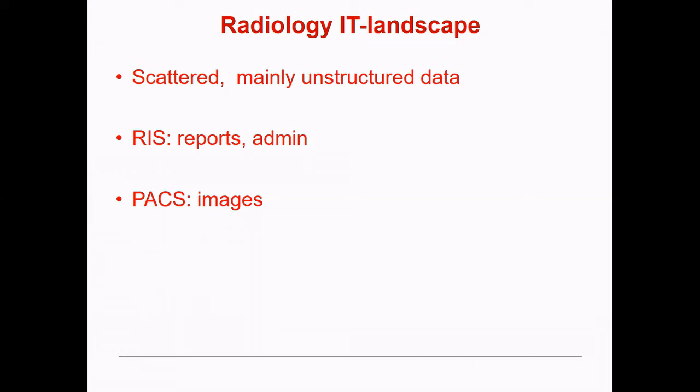First of all, even within radiology we have at least two silos. One is the RIS, or Radiological Information System. In there may reside reports, like the doctor's reports, but also the patients' visits and the whole scheduling, but also which doctor is doing which report, or which has done which report, and who has read it out.